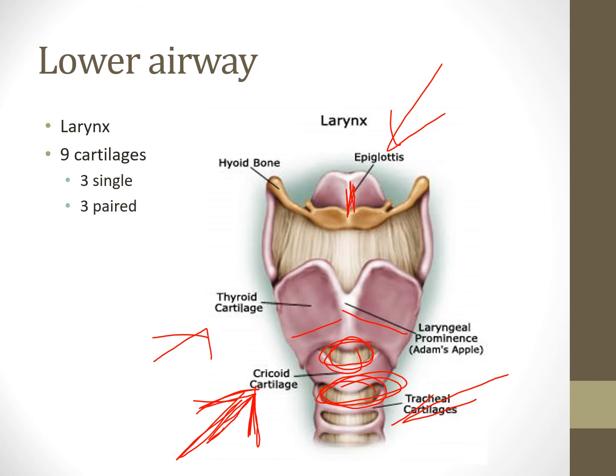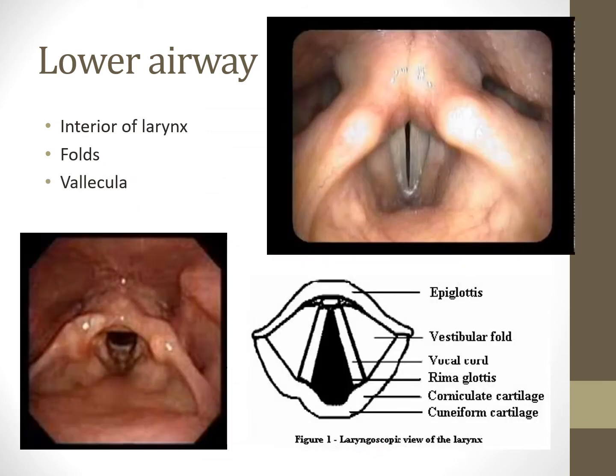So a lot less turbulence with a tracheostomy tube compared to a cricothyrotomy. So it's good to look at these. It's good to go back over all these airway structures, especially when we're doing a bedside percutaneous tracheostomy procedure on a patient, compared to an open trach, or even compared to a cricothyrotomy. You're going to want to know the anatomical differences and the why behind why they would pick a cricothyrotomy versus a tracheostomy.